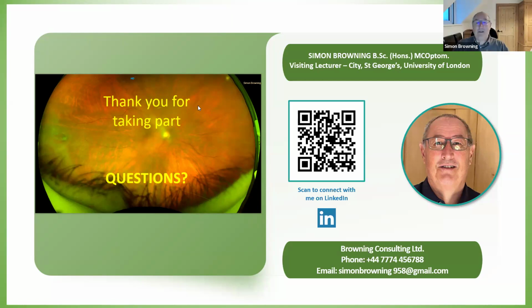So the feeling more and more is yes, we should, and that's why I said in the lecture that you won't go far wrong if you look at your next piece of kit after you've bought your ultra wide field imaging device. Your next piece of kit should probably be a biometer.